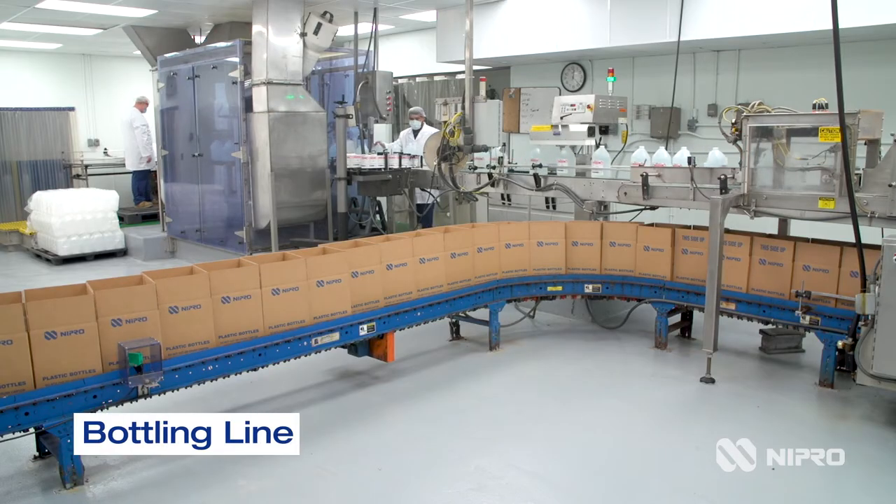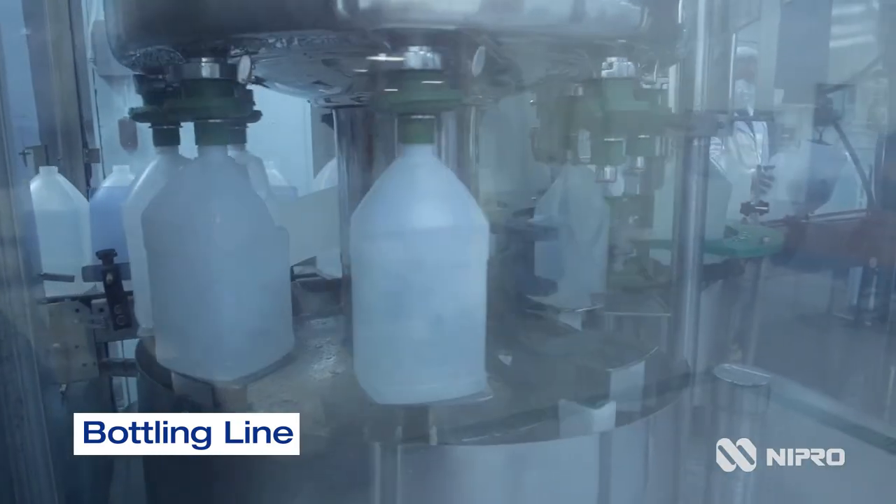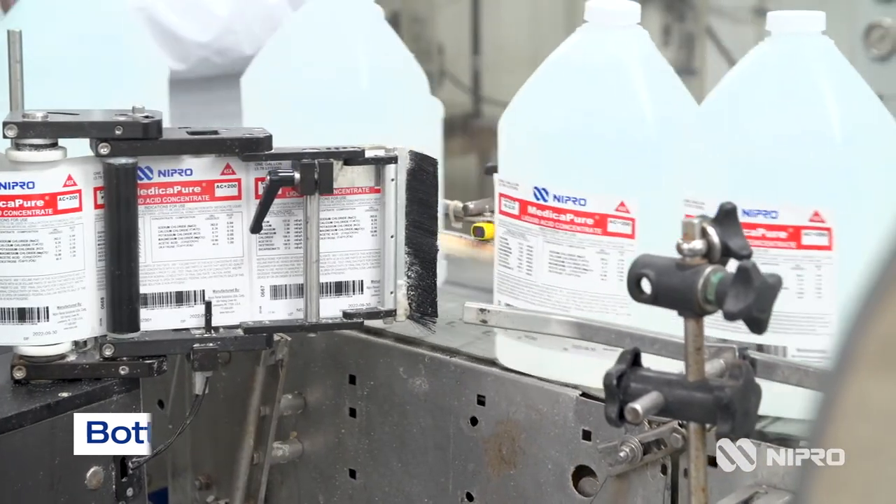At the bottling line, one-gallon bottles are filled and capped inside a clean room enclosure. They are then labeled before going through the induction sealer and packaged.